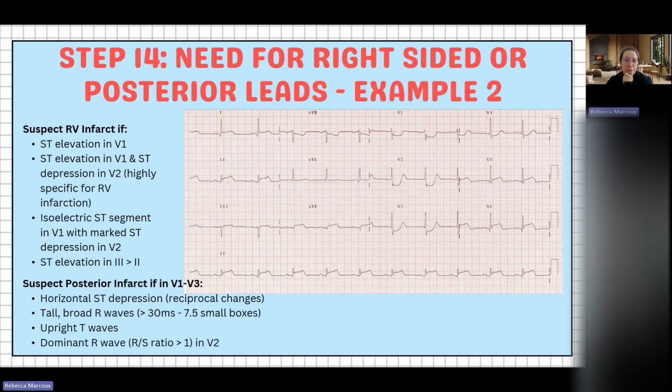So first thing, I see Nina's typing. Perfect. I think I can see ST depression and kind of a reciprocal change there, in V1 and V3. Yeah, absolutely, Rachel, and Nina. So you have V1, V2, V3 ST depression, which again is often a sign of reciprocal changes, and we want to check our posterior leads.